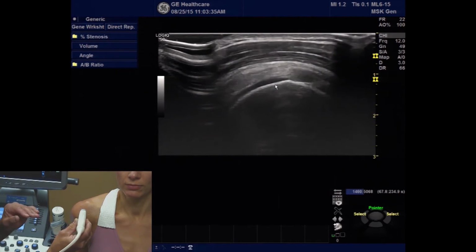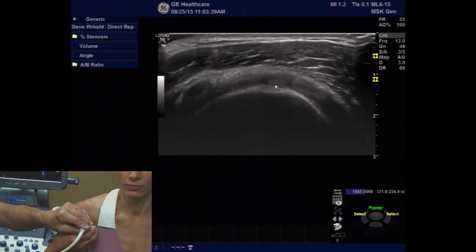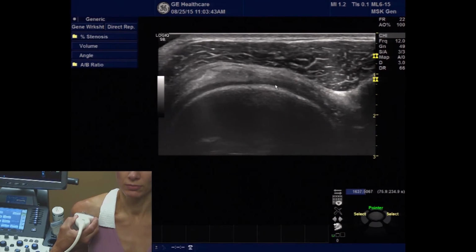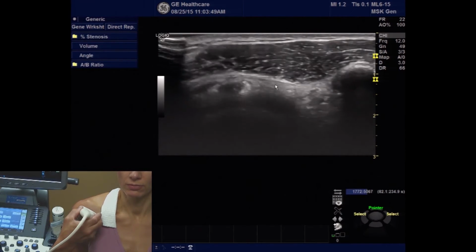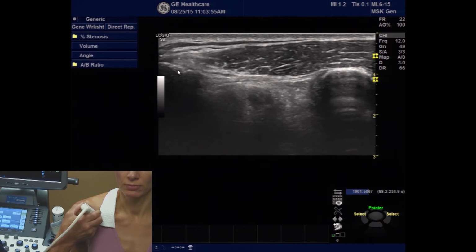Sliding the transducer back medially, I'm going to use both hands. I'm going to turn the transducer orientation marker so that it's pointing out laterally. So I will be looking at a short axis of the tendon. And I will move the transducer up until I see my initial bone landmarks again, which are going to be the coracoid process medially, the acromion laterally. So we're looking for the coracoacromial ligament spanning those two bone structures.